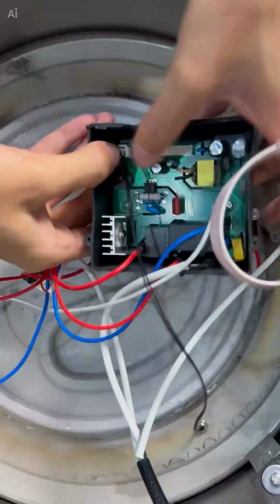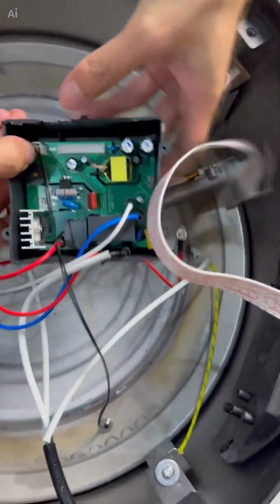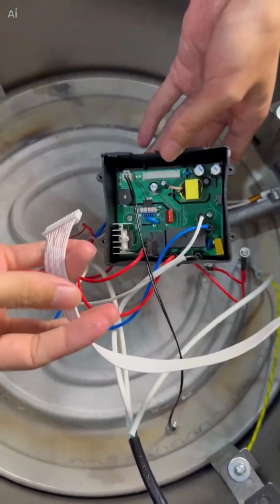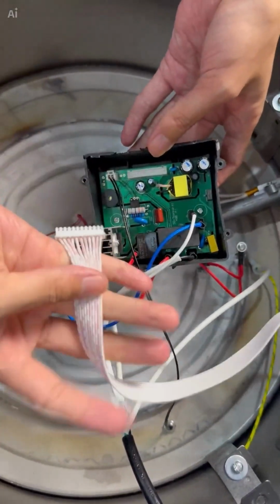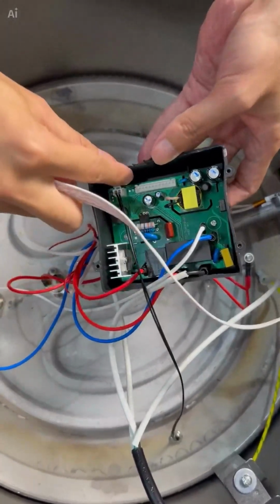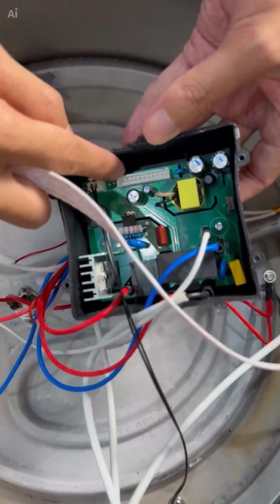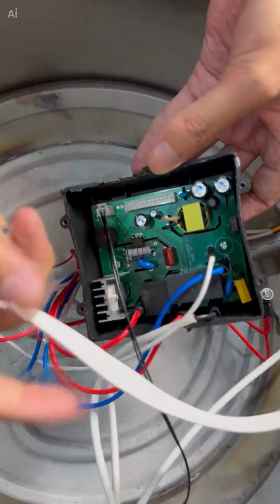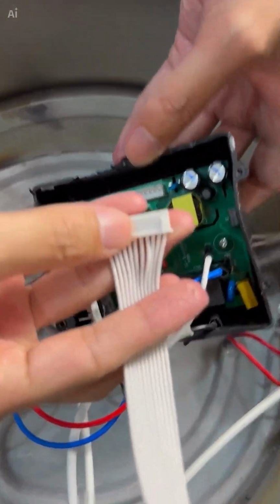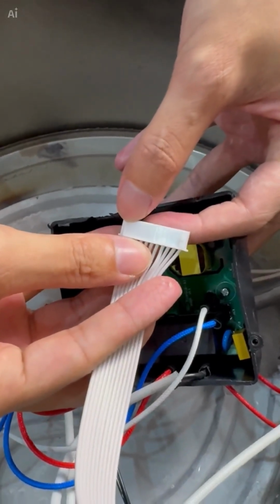Okay, make sure it is securely connected. Press it. Then the next step is to find this display panel. The display panel's ribbon cable is connected to this plastic terminal. Then you can see that the terminal on the power circuit board has 2 notches, and we also find that the ribbon cable on the display board has 2 protrusions, this protrusion and this protrusion.